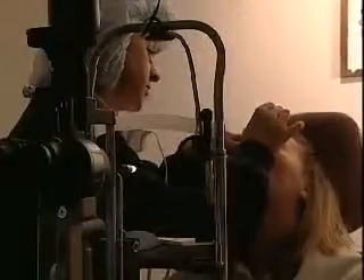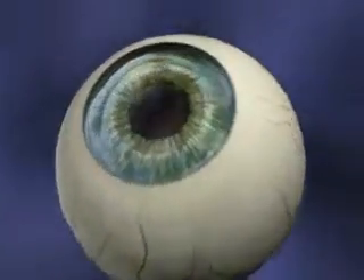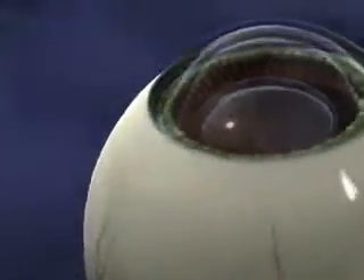On the day of your procedure, prior to surgery, your surgeon will administer topical anesthesia to minimize discomfort. However, you may still feel pressure in your eye. Additionally, you may or may not be given a sedative. Once you're comfortable, your surgeon will begin the procedure.